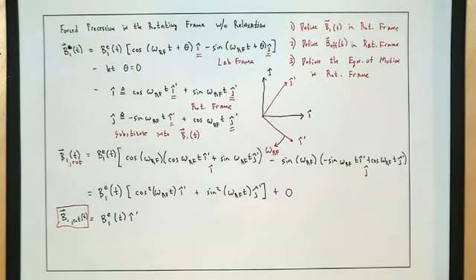And so the whole point is to say that in the rotating frame, the way we see the action of the B1 pulse is much simpler, and it's just this pushing down along a single direction. There's no sines, there's no cosines, and that links back to that movie that I showed you, the magnetization just tipping straight down. It's not precessing around in some crazy way at the same time, it's just pushing down along a single direction. We kept it simple by getting rid of the phase. We could make it more complicated by adding the phase, so we could tip in any direction according to the phase, but we didn't do that now.